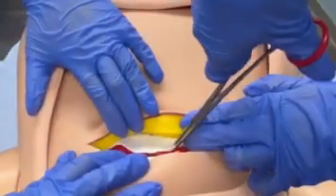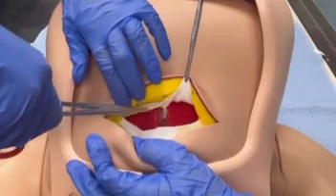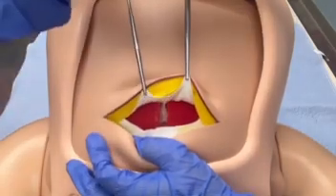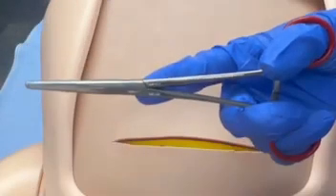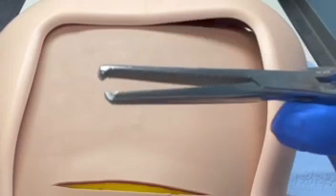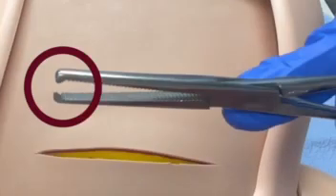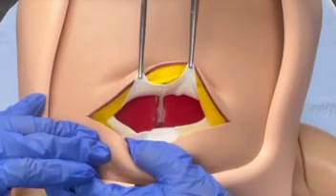The superior fascial edge is then grasped with Kocher clamps on either side of the midline and elevated to separate the fascial sheath from the underlying rectus abdominis muscles. Kocher clamps are a type of tissue clamp that feature transverse serrations on the inner jaws with 3 interlocking teeth designed for grasping tough, fibrous, or slippery tissues such as fascia, shown here.